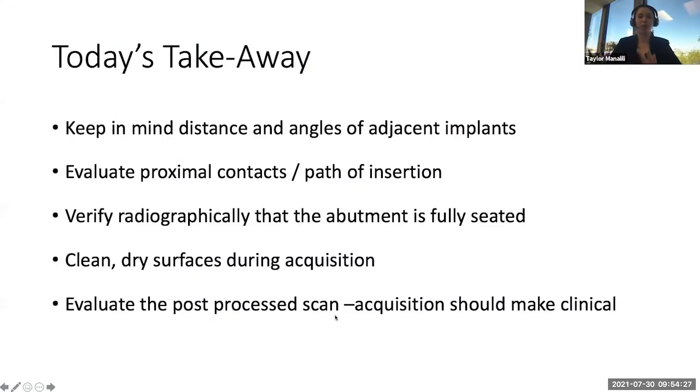All right, so the whole point of this, we only have 5 minutes left. The big takeaways from today that I really want you all to go home and try in your offices: keep in mind, if you are scanning a case, not every case right now is okay to do with scan bodies. Some of them really do require conventional impressions or very specialized scanning software that is out there. They require additional scanners, additional scan body types, which I didn't talk about today, but we have people utilize those when they do these big full arch cases, but it is a whole other system.